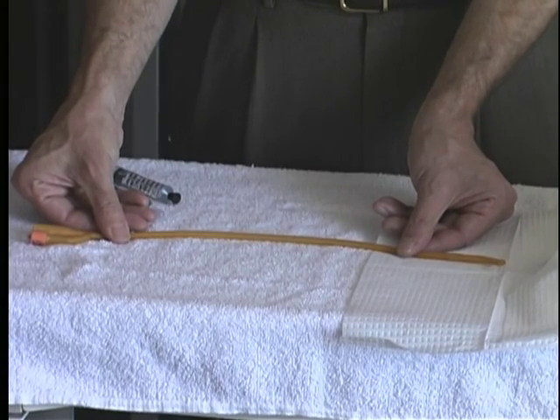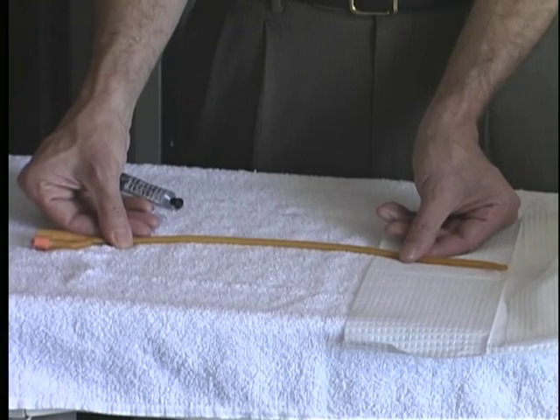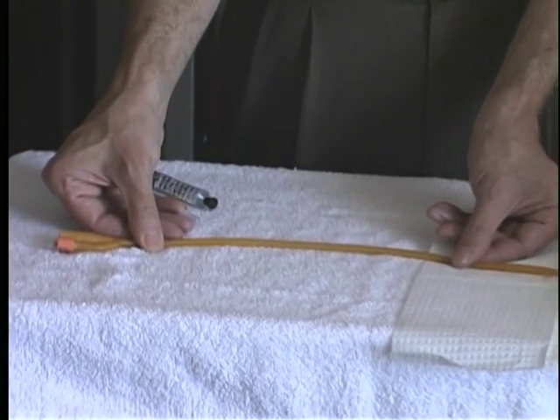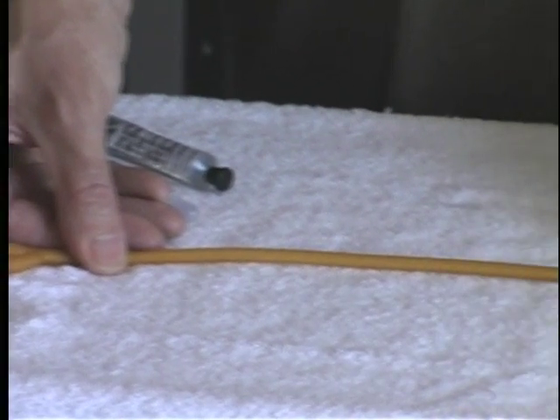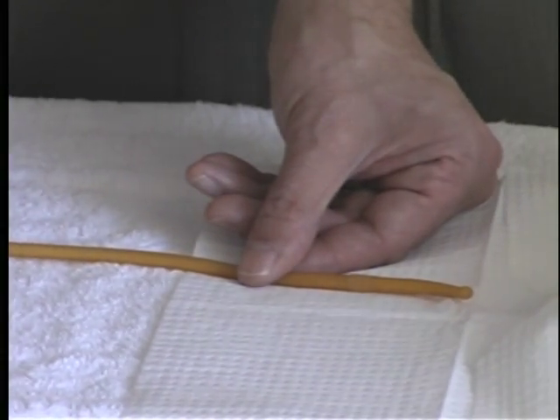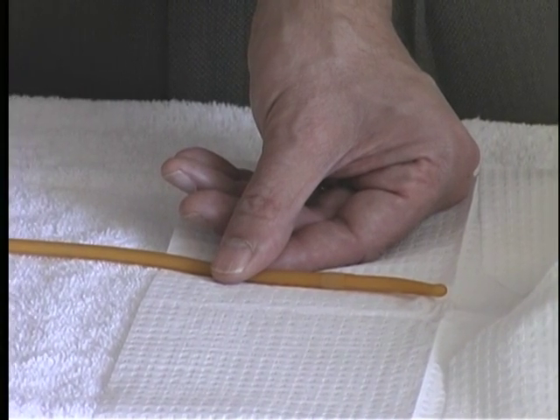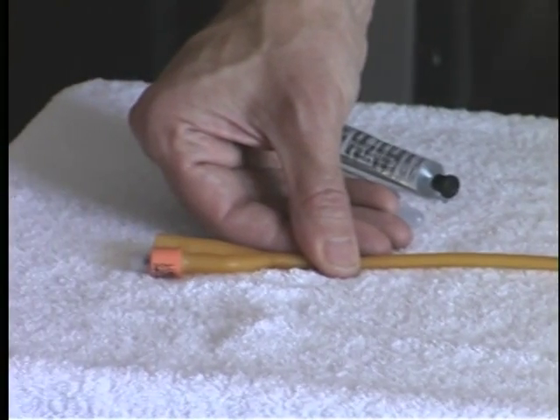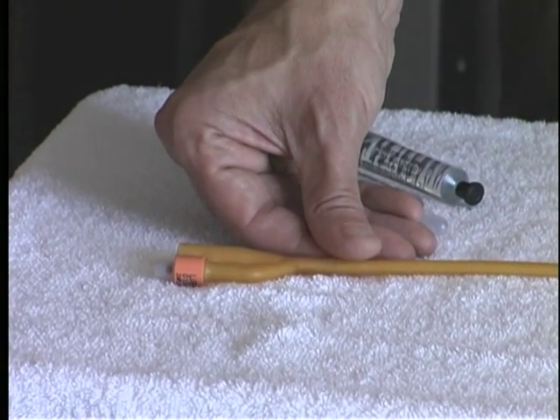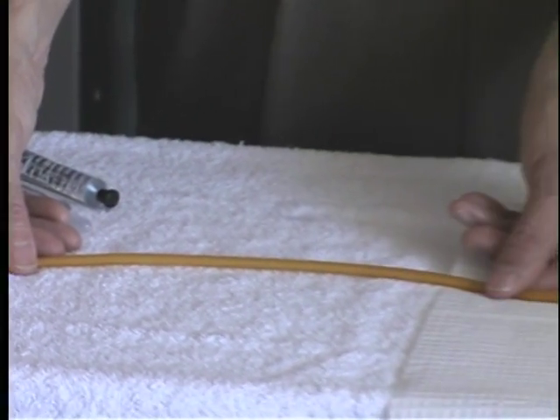Coude catheters come in a variety of sizes, and they also come in a variety of materials. It is possible to obtain latex-free as well as latex Coude catheters. Your average Coude catheter will be a 16, 18, or 20 French catheter, and in general we recommend the larger catheters because they are somewhat more firm and they will traverse that area of irritated prostate or prostatic enlargement to facilitate appropriate passage.